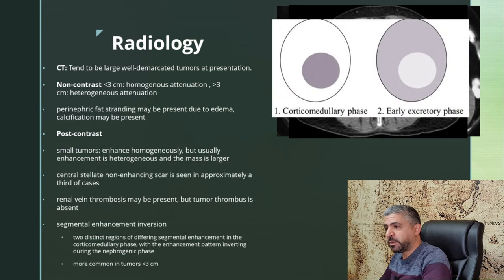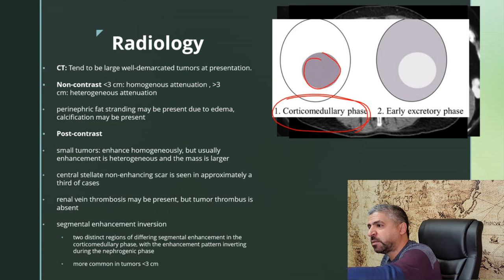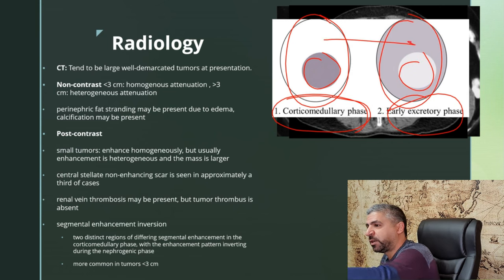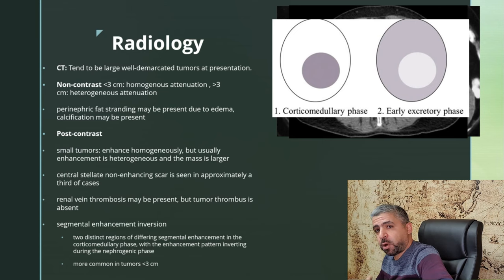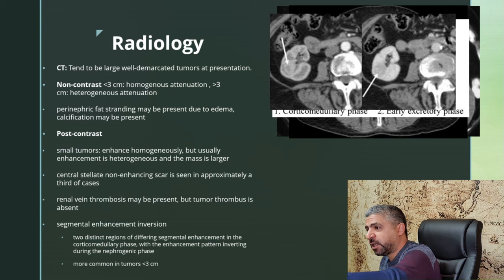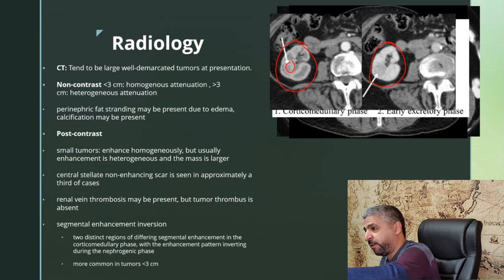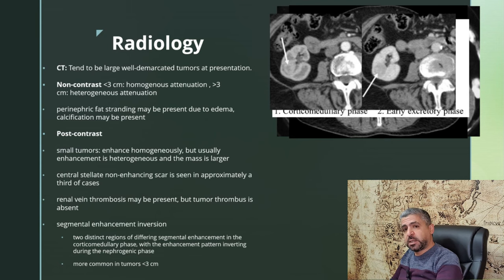Now, the segmental enhancement inversion sign: in the corticomedullary phase the lesion enhances more than the surrounding kidney, while in the early excretory phase the lesion enhances less than the surrounding kidney — an inversion on two different phases. This is a very useful sign, especially in small tumors, to differentiate oncocytoma from renal cell carcinoma. On this example, in the early corticomedullary phase the lesion enhances more than the surrounding kidney, and in the early excretory phase it enhances less — confirming the segmental inversion sign favoring oncocytoma.